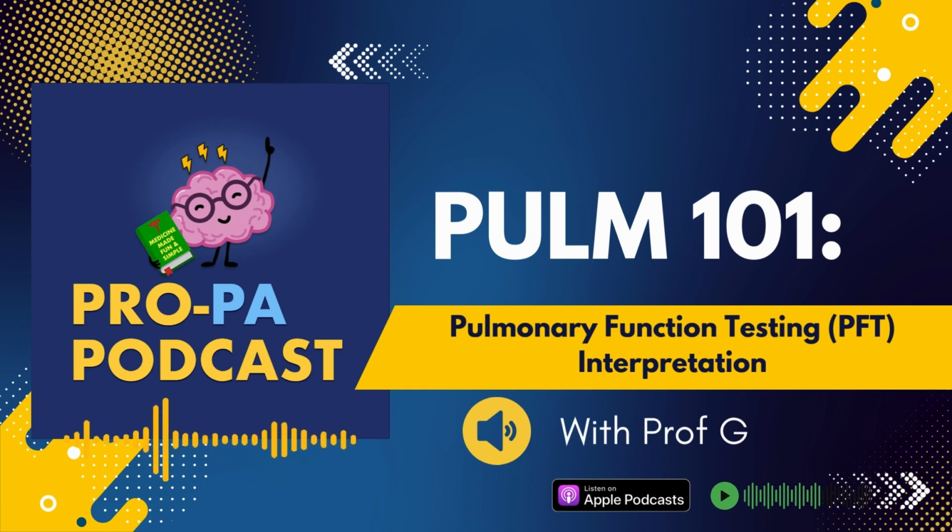All right, step 7, establish a differential diagnosis. One thing that makes it really tough for students to understand is they see a set of numbers, PFTs, and they think that in the real world, it's the set of numbers that have to be interpreted. However, in the real world, we have a patient that has those numbers.